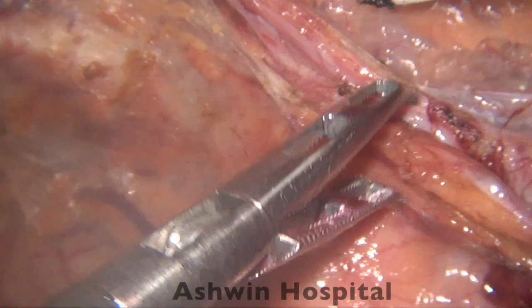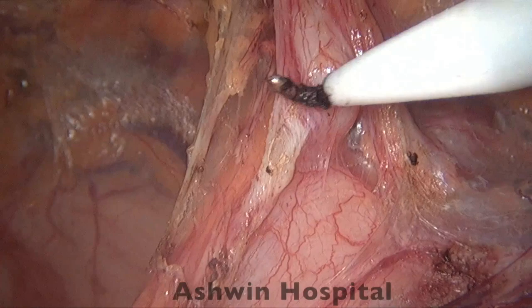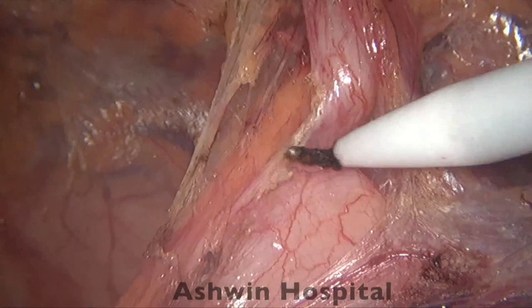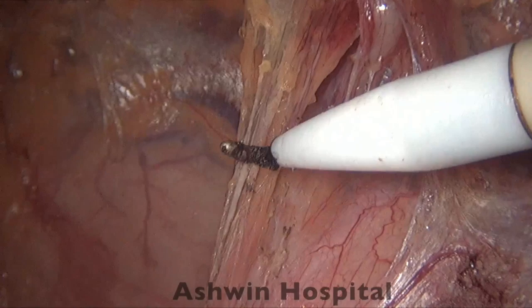So here again you can see we keep changing the traction close to the area of interest so that the pull can be good and we can do a fine precise dissection. Once again you can see how close we are working, but still it's quite safe and without any difficulty we can work, provided our traction is good and we identify the area where we have to work. Here we have a little bit of thick fascial attachments which we have reduced, and now the vas has nicely been mobilized away from our field of dissection.